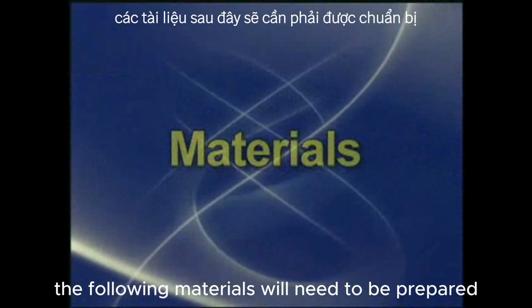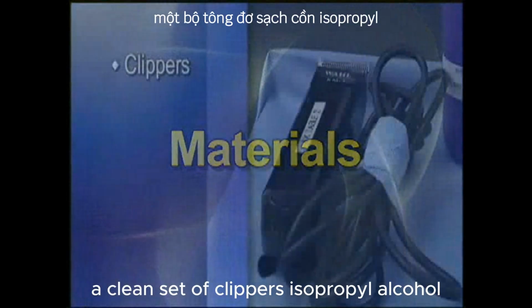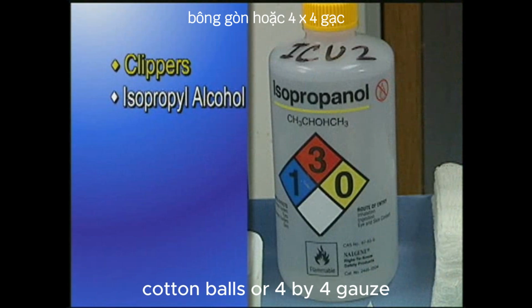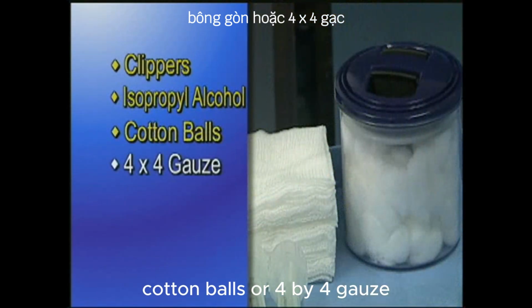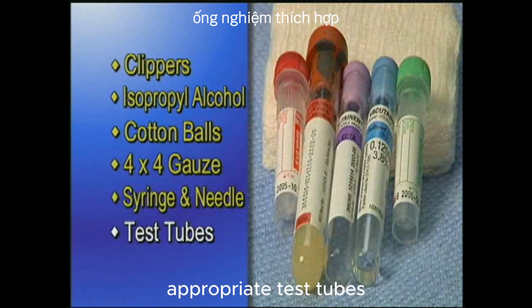The following materials will need to be prepared prior to beginning the procedure: a clean set of clippers, isopropyl alcohol, cotton balls or 4x4 gauze, a 3 or 6 cc syringe and needle, 22 or 25 gauge needle, appropriate test tubes.